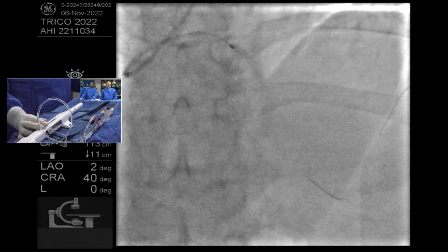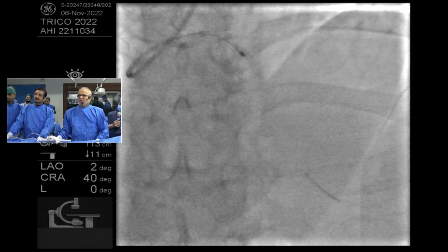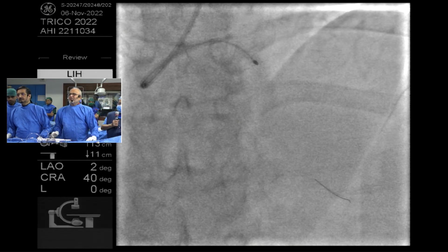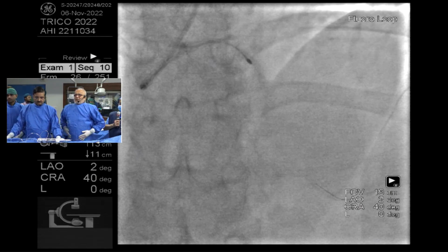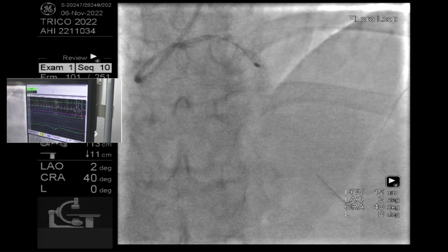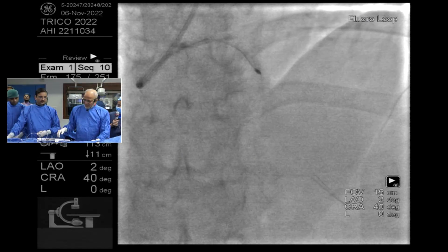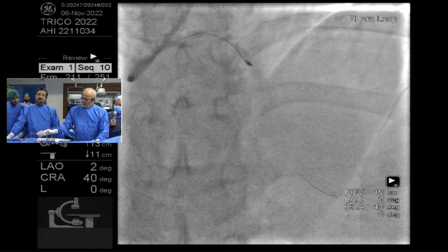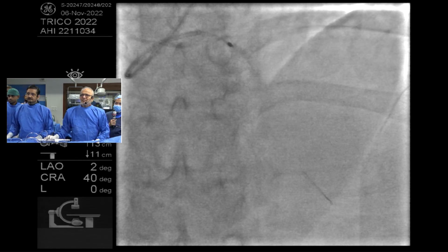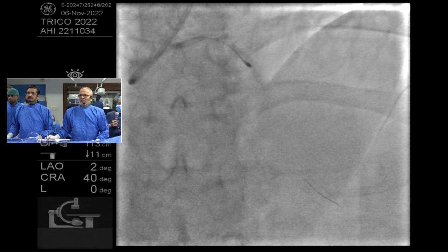Any hemodynamic change, any EKG change at that time? No. See, it's not going in. It's going to take a few passes. Would you like to increase it at this point or not? I would not even increase the RPM. I just do more attempts. Not at this moment. We will increase by 5,000 or maybe 7,000. Sure, it wouldn't hurt. I think the key is the duration of the run.